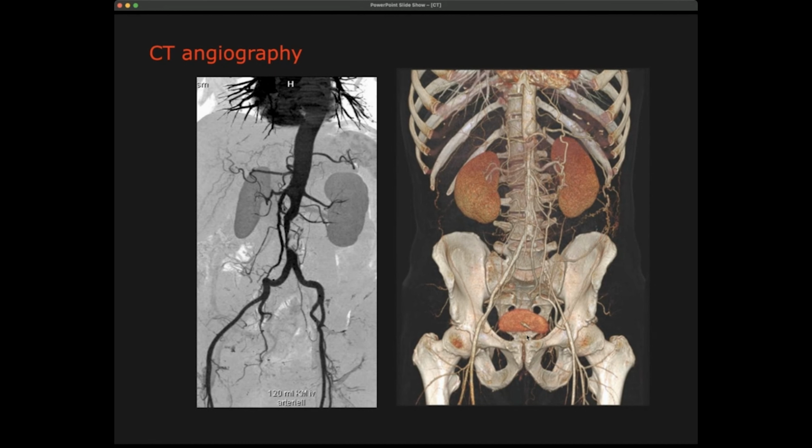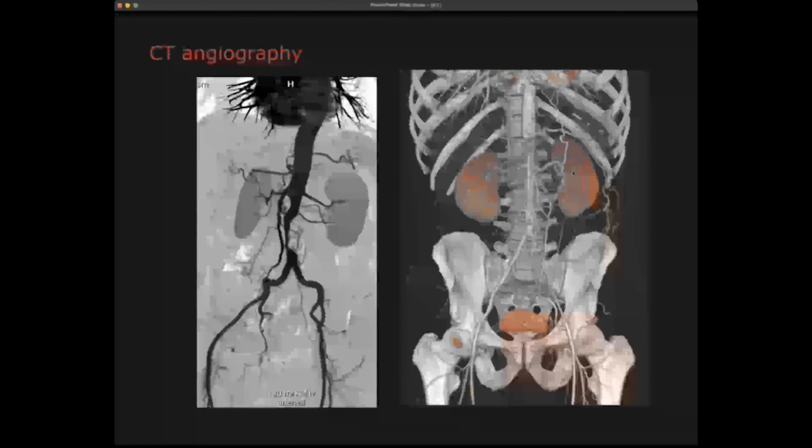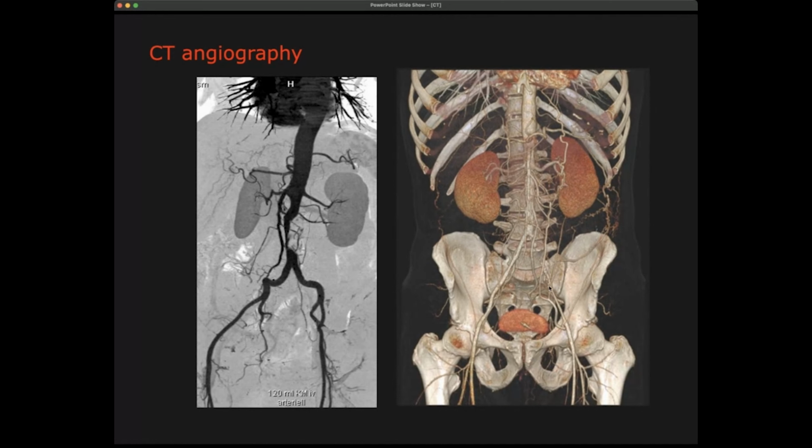And here, for example, also what you see here is this seems to be an organ that captures a lot of contrast. And when you think about it, what is there very low in your pelvis? That's of course your bladder, so your urine bladder. So what happens is the kidneys, and you see from the kidneys these things going towards the urine bladder. So the kidneys take out the contrast of the blood, and then it's being accumulated in the bladder until the patient goes to the toilet and then excretes the contrast, of course.